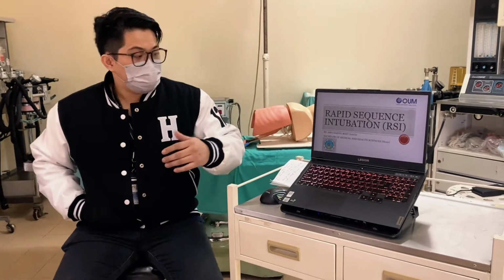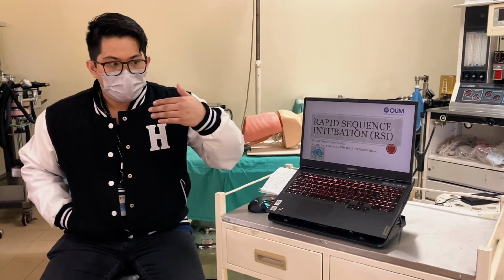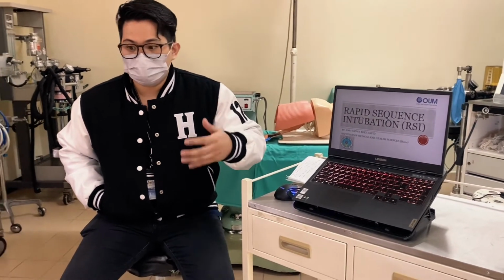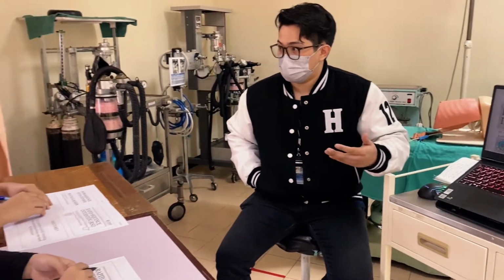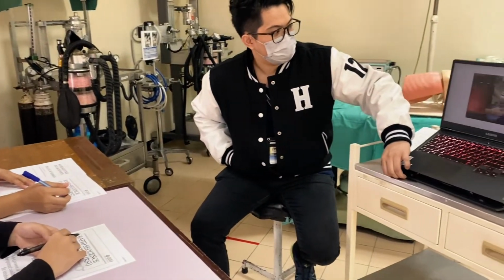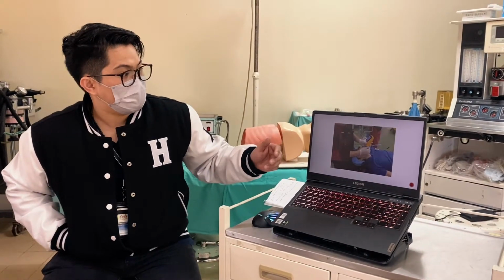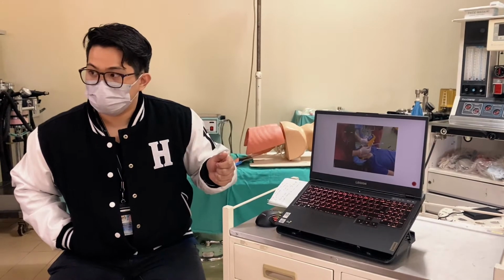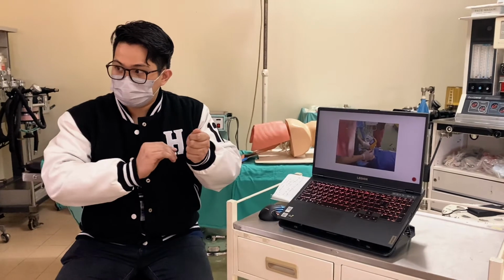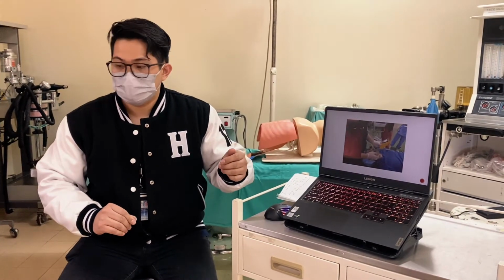Now, when we speak about rapid sequence intubation, we always think about what we should do when a patient needs to be intubated. When we say intubation, how do we know? This is one of the videos that I will be showing you, of how an anesthetist performs an intubation on the patient, where they put the endotracheal tube towards the vocal cord and then let the patient ventilate by himself.